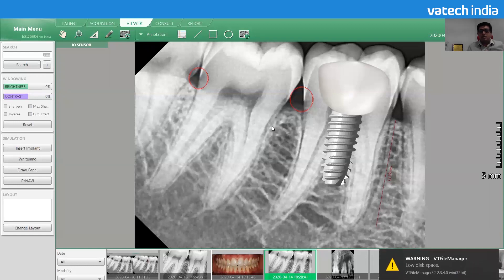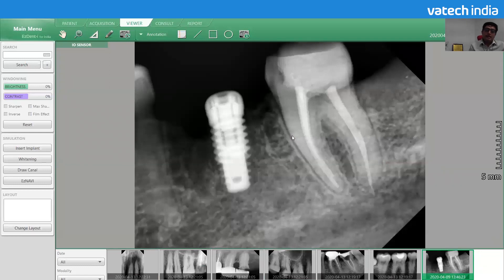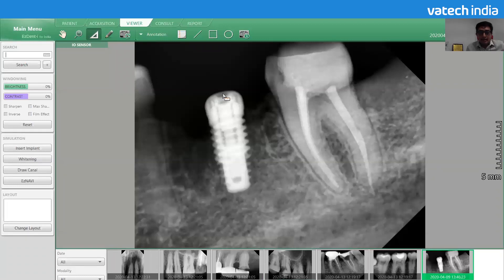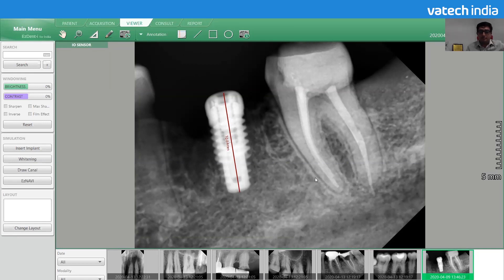Let me show you how to make this measurement correct in the software. The first option is if you have a known object in the X-ray. For example, in this X-ray image we have an implant which is a known object. Before taking the X-ray, we know the length of the implant — let's say 9mm. After taking the X-ray, the implant is showing around 10.8mm, meaning there is a deviation in the measurement.